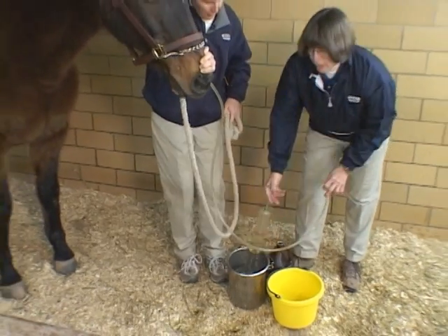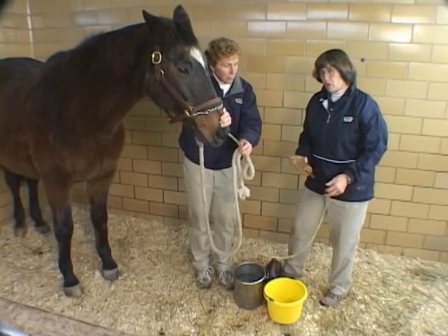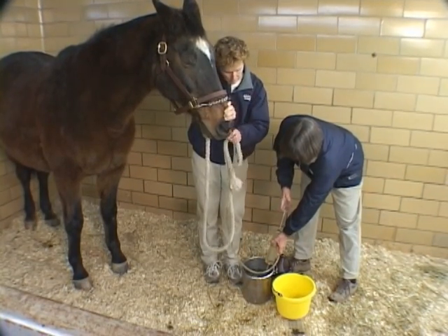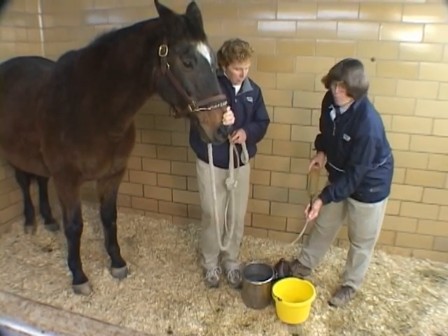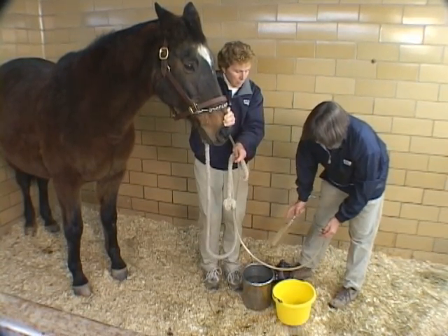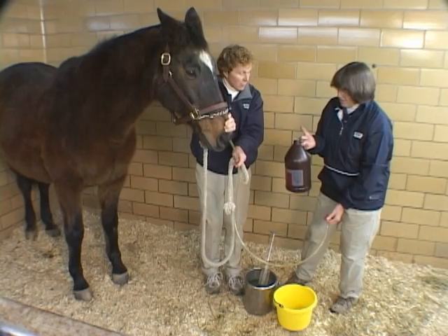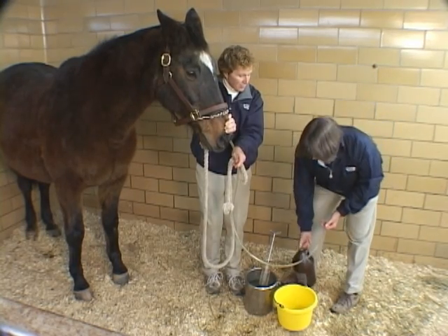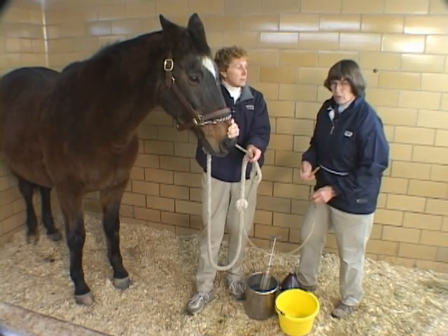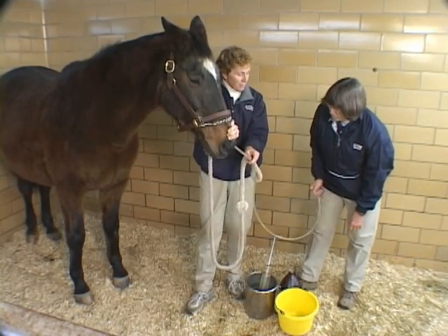If we were dealing with a colic case, you might then be asked to put some mineral oil and some water down in the stomach, in which case we would just be filling this with water and putting it down into the stomach. This is our mineral oil that comes in a container such as this — it's messy stuff to deal with. We often will give colic cases a half gallon to a gallon of mineral oil, so there are sizable types of volumes that we'd be giving.